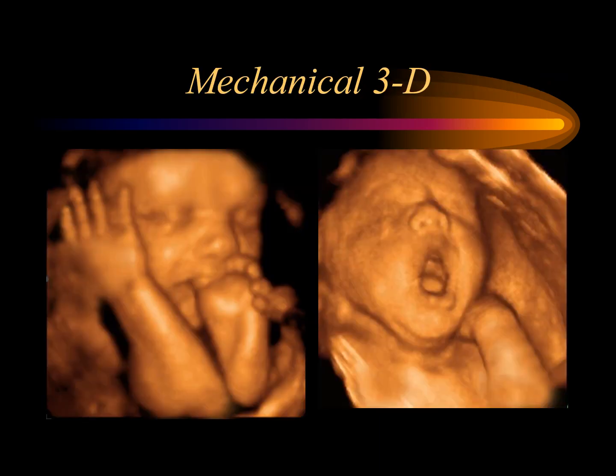Here are some cute three-dimensional images that are created with the use of that mechanical 3D probe, and these are most commonly going to be used for obstetrical scanning.